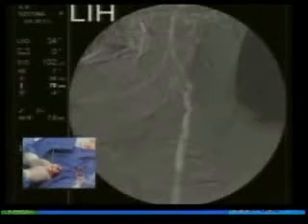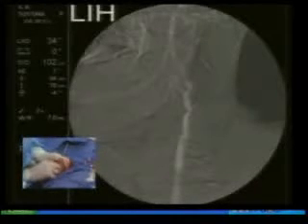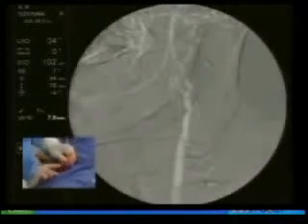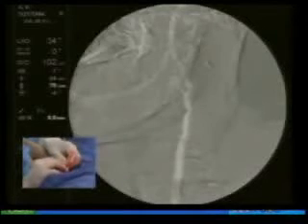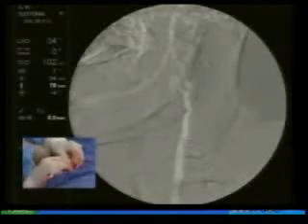Mark Krieger, do you ever see yourself looking at an ultrasound at a plaque and saying to somebody, you ought to use flow reversal for this because it looks like an embolic or emboligenic plaque? No, I don't actually recommend to the interventionist which type of distal protection device to use, but I do increase their awareness that it's an unstable looking plaque that is friable or likely to embolize, and then let them decide.